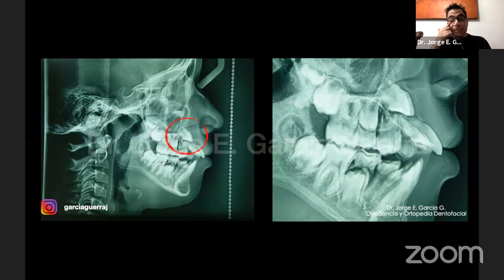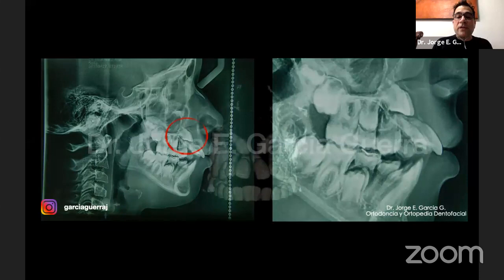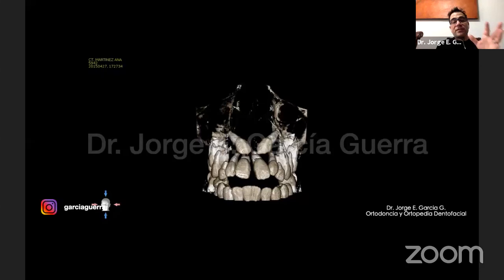Okay, so you can see the position of the incisors, how they're protruded because of the canines. So look, this is the CBCT also from this patient. And you can see on this case, the right canine was resorbing the root of the central incisor. Now, the canine on the left, if you look at the lateral incisor, we have a small crown size incisor there. It's like a peg crown shape. And the canine is between the roots of the central and the lateral incisor. You can see this on this lateral view.